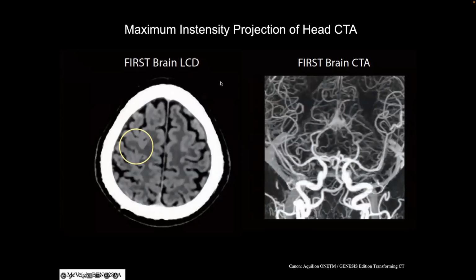So this basically is what a brain looks like when you inject contrast into it. If you can see beyond this, the hardest thing in CT in the early days was seeing through this bone, right? So that you could see soft tissue contrast, because the X-rays were absorbed so highly by the bone, it caused great edge effects. But then if you inject a contrast agent, you can get these ridiculously high resolution pictures of angiograms of people's heads.